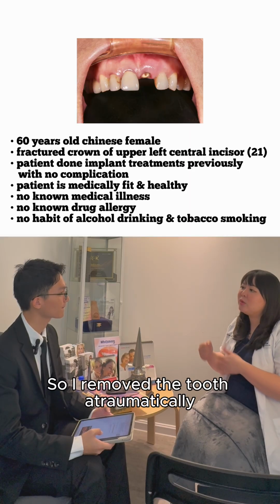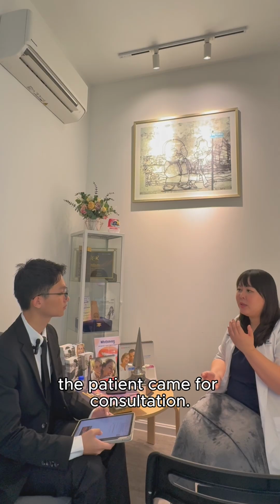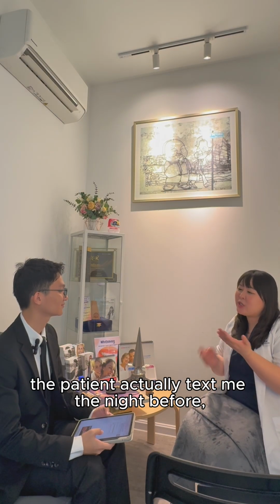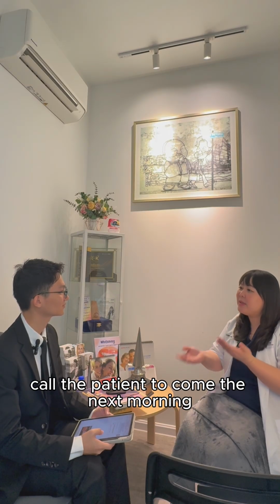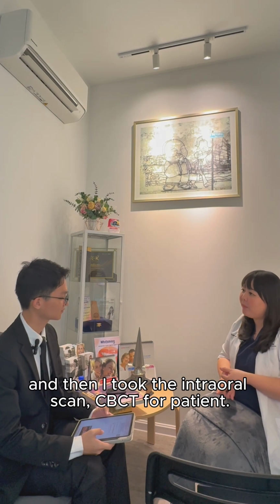So I removed the tooth atraumatically. During the same day, the patient came for consultation. I remember the patient texted me the night before, so I called the patient to come the next morning and check. And then I took the intraoral scans and CBCT for the patient.